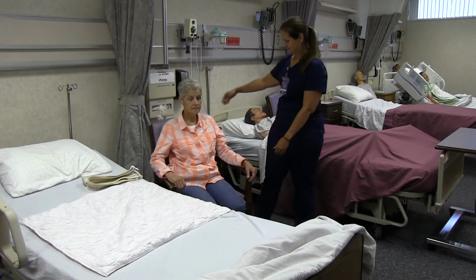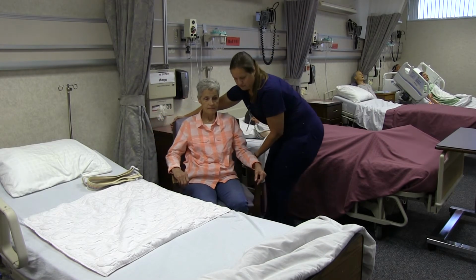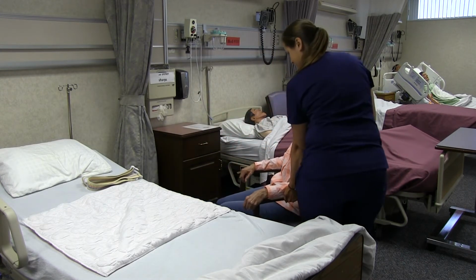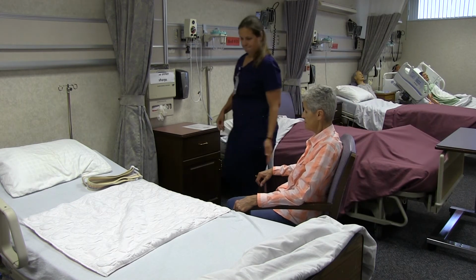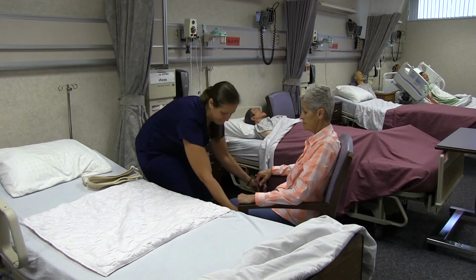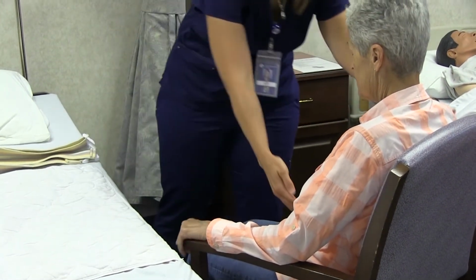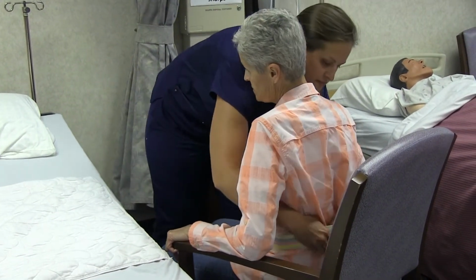Now we are going to be demonstrating positioning a client from the chair to the bed. Steps 1 through 8 are assumed, and this patient is also weak on the right side. We position the chair to ensure client will be placed in the center of the bed, lines up client's knees with midpoint of mattress. Assist client to edge of chair. Applies gait belt snugly at center of client's gravity.